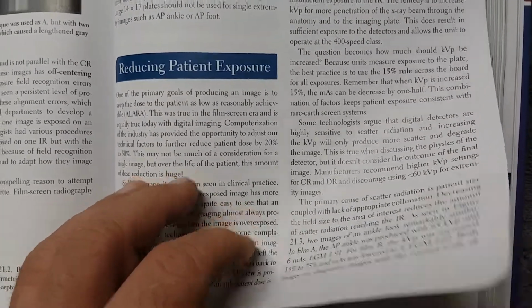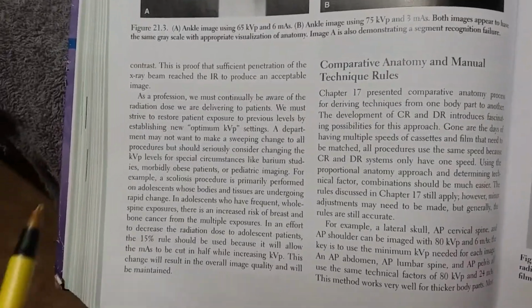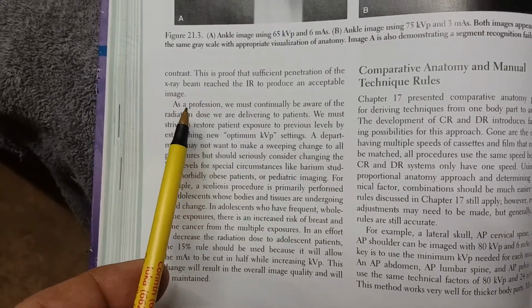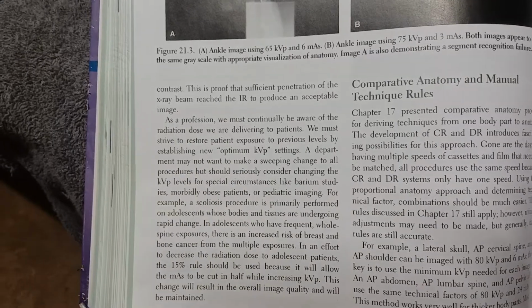Okay, so increasing kV is a very good way to maintain the exposure to the IR and still not increase patient dose, because higher kVs mean better penetration through the patient and less absorbed dose to the patient.